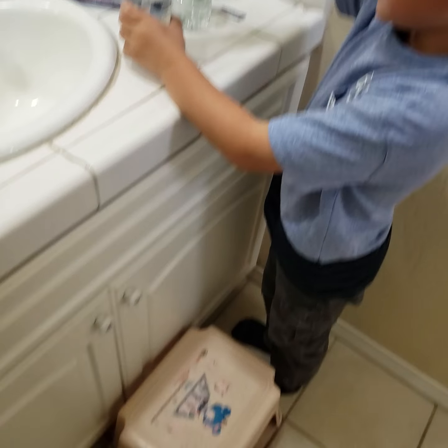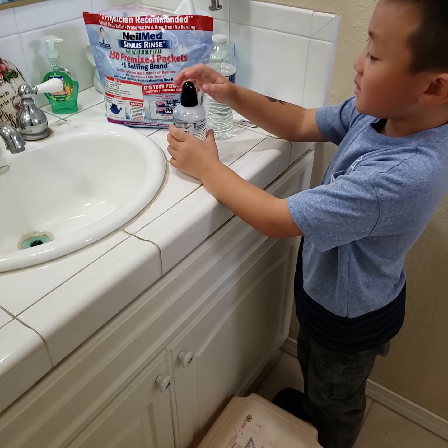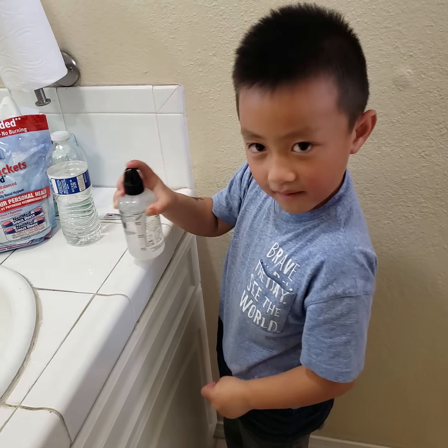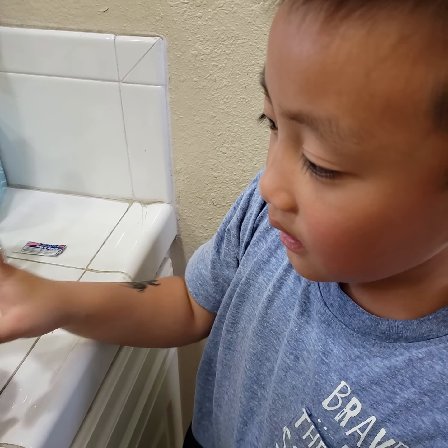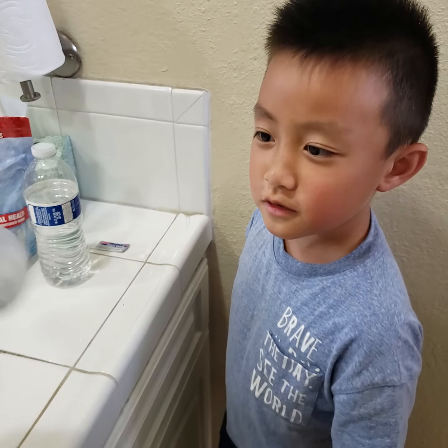Okay, and now we're going to close it. Close it a little bit. And then hold the top with one hand, and then shake it. Shake it harder, more. Let mommy help too. And shake it really hard to make sure it's mixed, right? Yep.